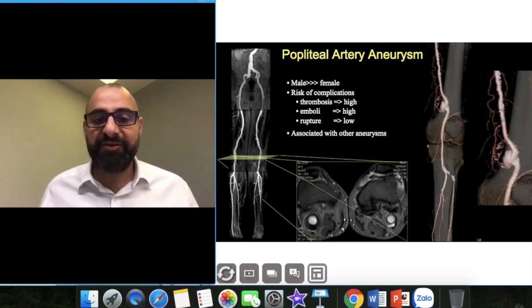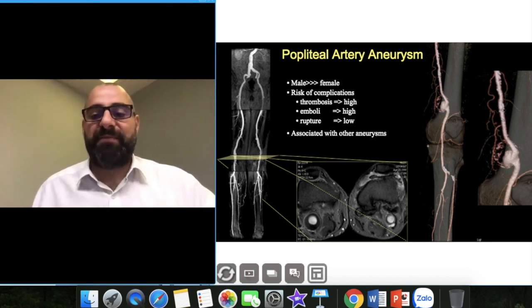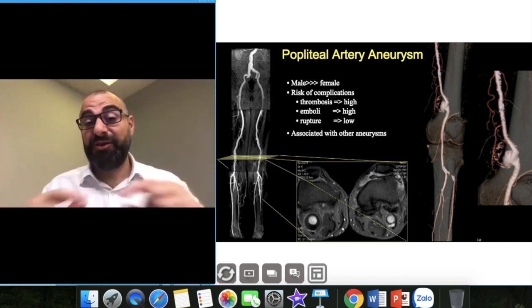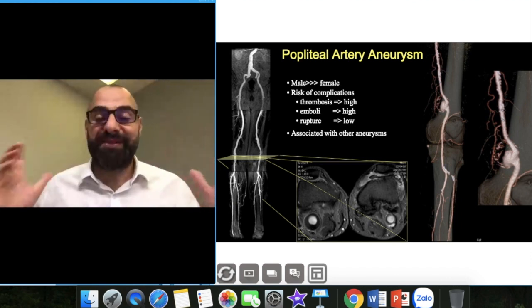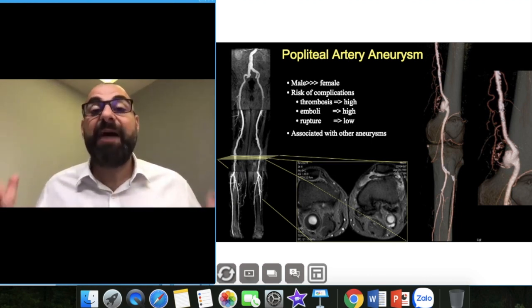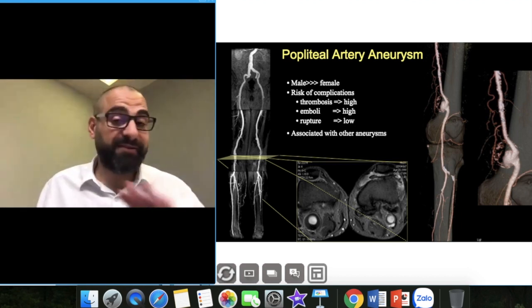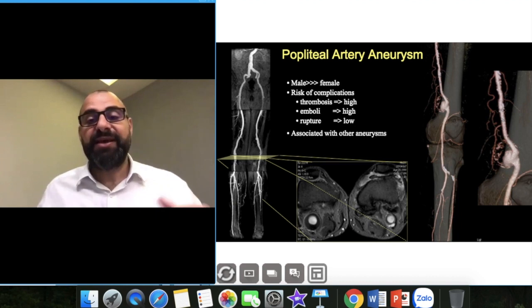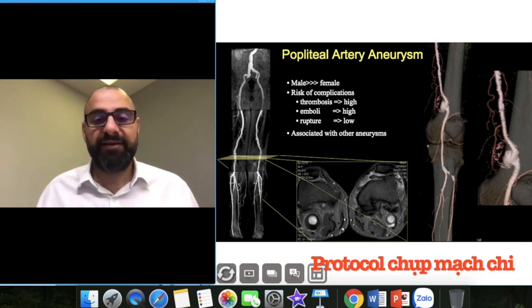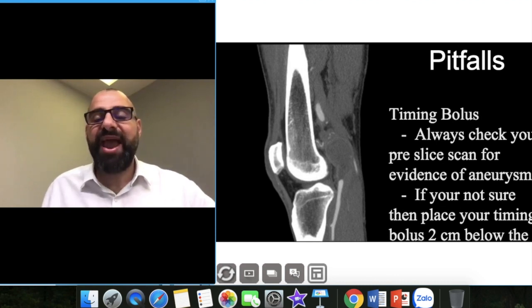Popliteal aneurysms are very common, which is why I like to monitor at the popliteal fossa — pathology usually sits above the knee joint. I always put my region of interest at the knee joint itself because 90% of pathologies — whether stenosis or aneurysms — happen above the knee joint. This is based on my experience, not formally proven. So whatever pathology is present, I'll always be safe placing the ROI there.